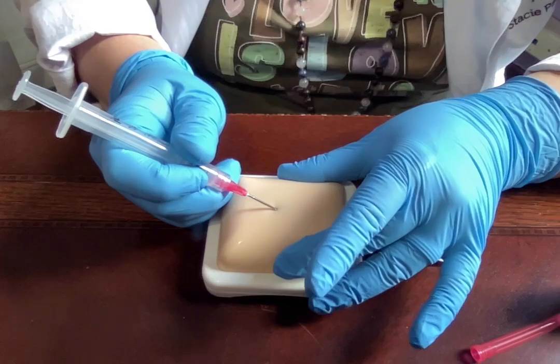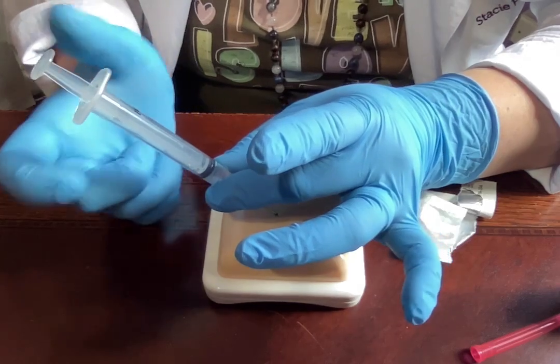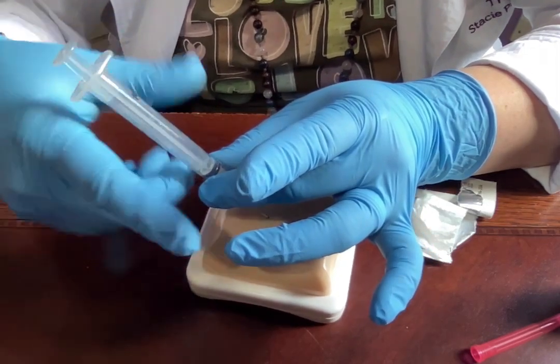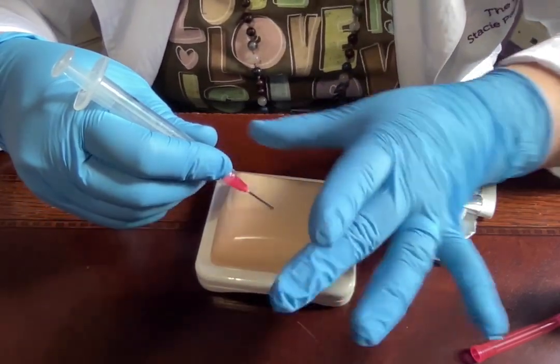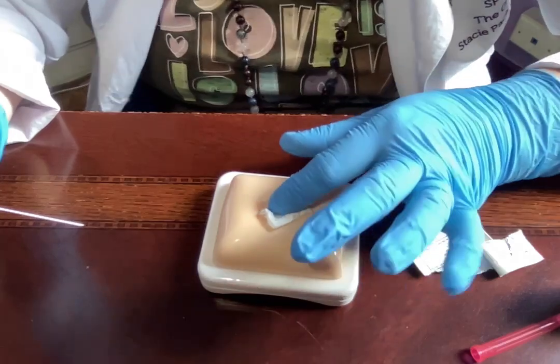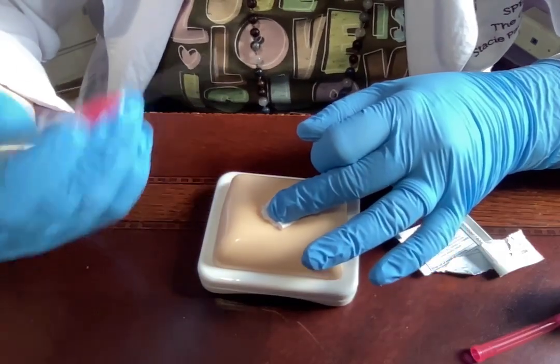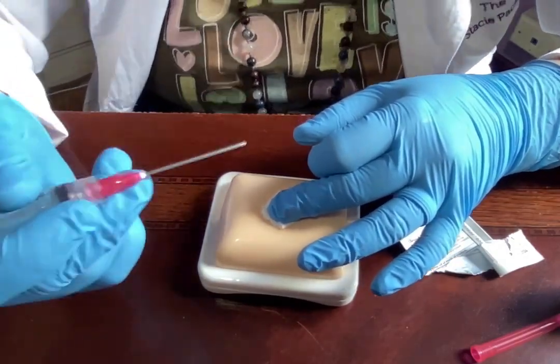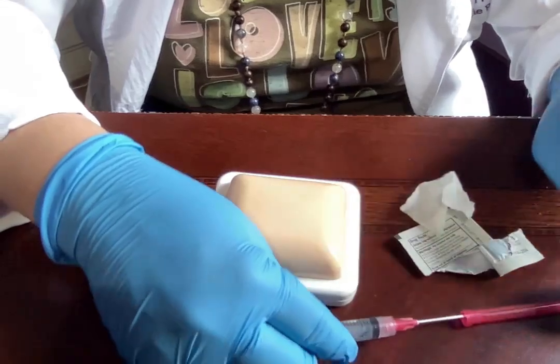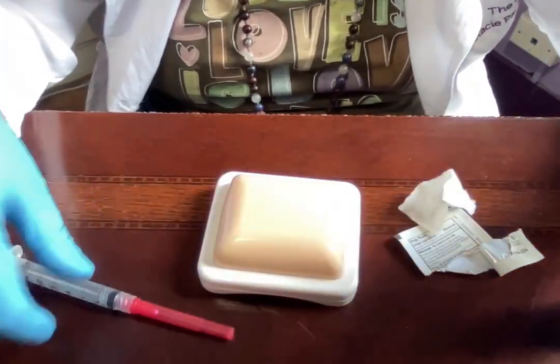Flip and pull out the needle, set aside. Ready to inject. Give a little pinch to raise the fatty tissue, position at a 45-degree angle, and with a dart-like motion insert about a half inch to three-quarters inch deep. Release the pinch, grab the bottom of the syringe for stability, and slowly inject the medication — it'll take longer than it looks since it's thick. Pull out, grab your alcohol wipe or cotton ball, and hold for one to two minutes if needed. Then dispose of the needle in your sharps container or use the fish technique to recap.